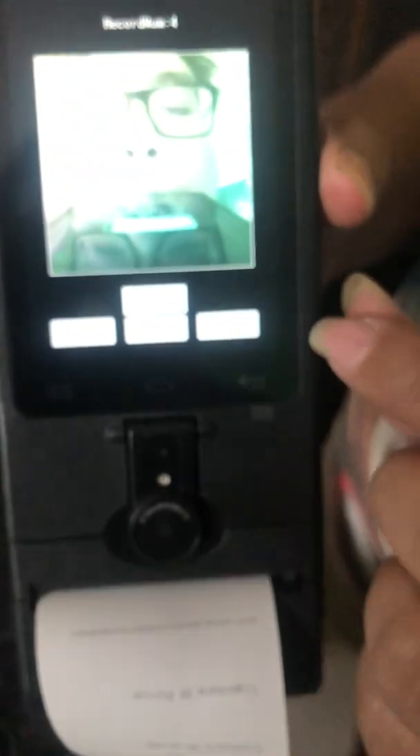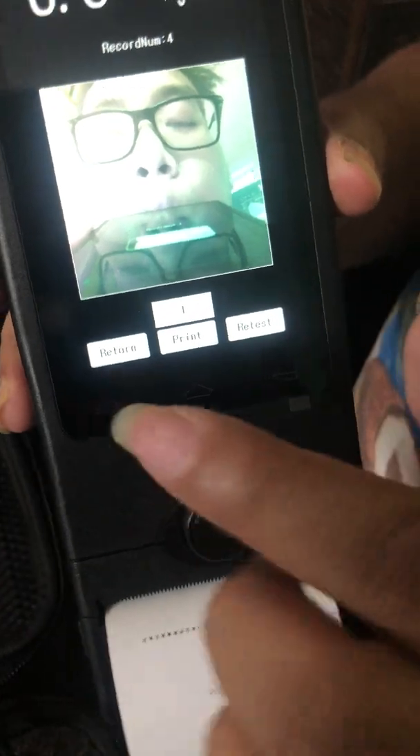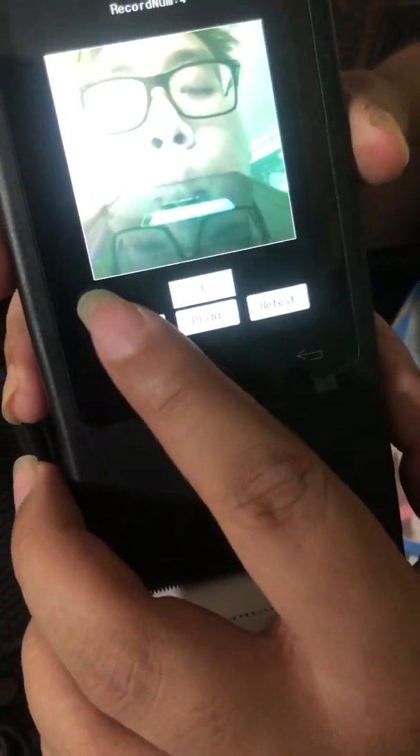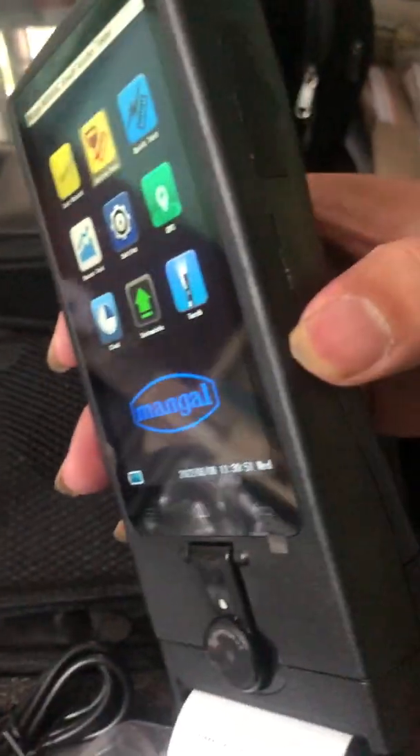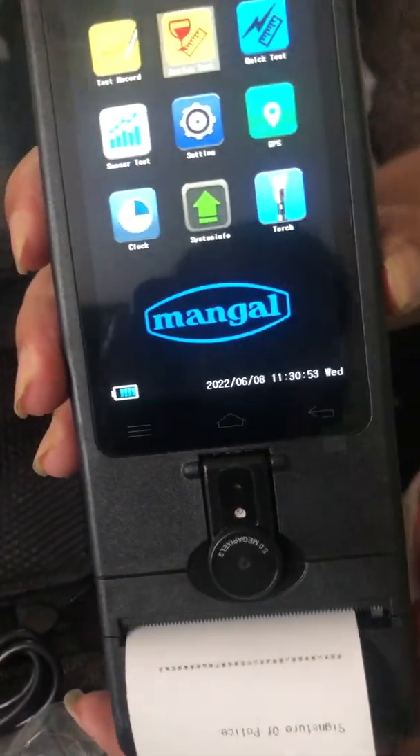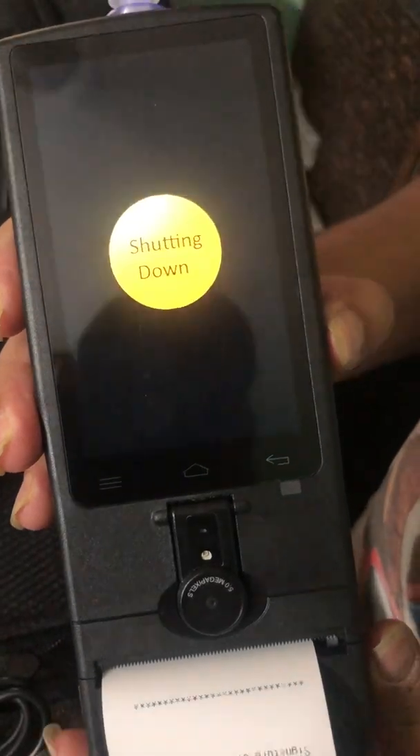Now, if you want to do the retest, you can press that option. And if you want to return to the main menu, press return here. And in order to power it off, you just have to hold the power button for some time, then it's off.